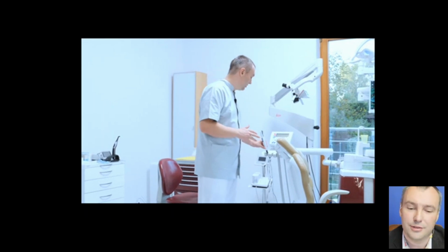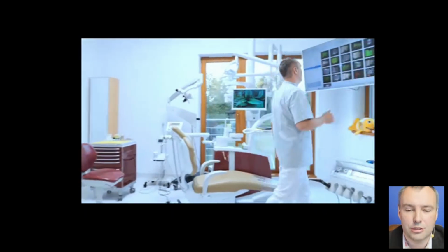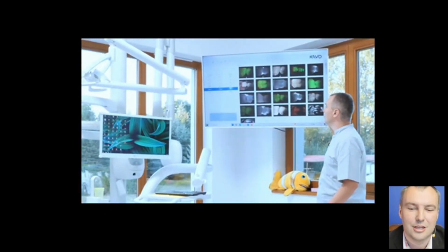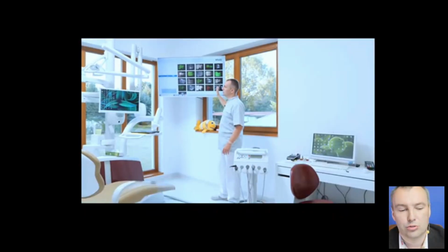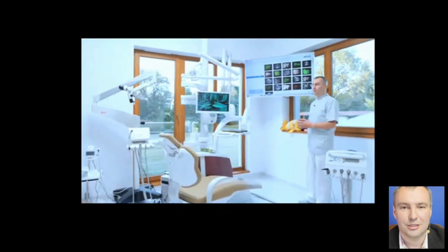DiagnoCam Vision is handy, so I will use it as a first device for the diagnosis, and it will always be used at such a visit. But the most important device that you can see in my dental office is as large a TV screen as possible. This one is 55 inches, a normal TV, built on the wall about 2 meters from the patient's side.